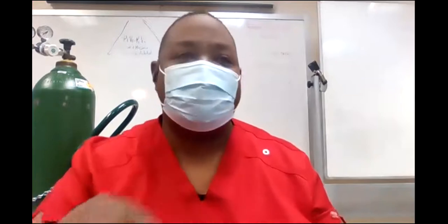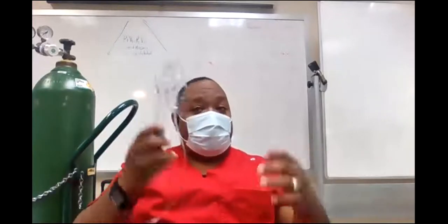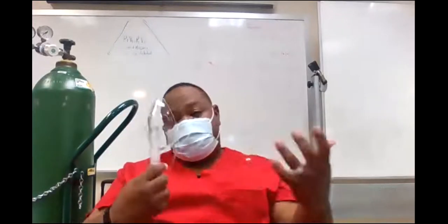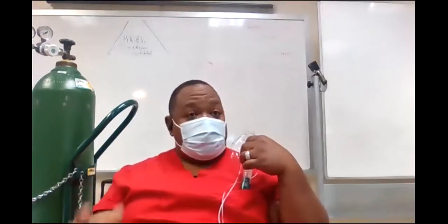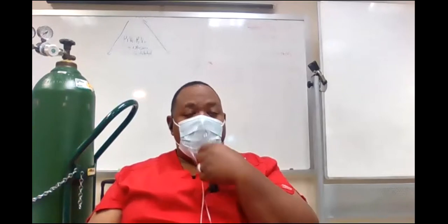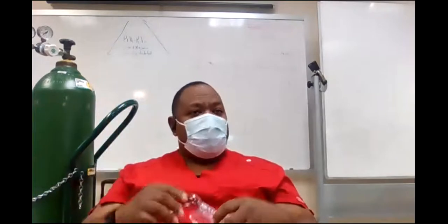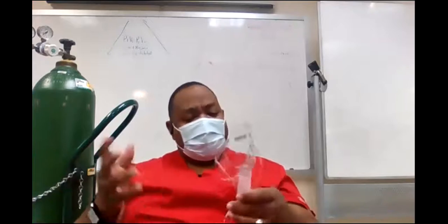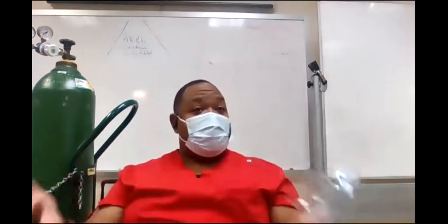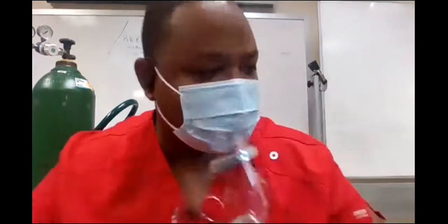Oh, there it is. So if they own a 28% Venturi mask and you want him to get 28%, but every time he takes his mask off and tries to take a couple of bites, he gets short of breath, he starts getting blue, he has to put this right back on, right? Well, Mr. Johnson, what we're going to do is just put you on a nasal cannula at 2 liters, which will give you about 28%, as long as he's breathing regular and calm, right? I can give him about 28% and he can eat, all right? So that's the kind of decision you would make on your own as a respiratory therapist, all right? Well, let's switch him to a nasal cannula at 2 liters, all right?